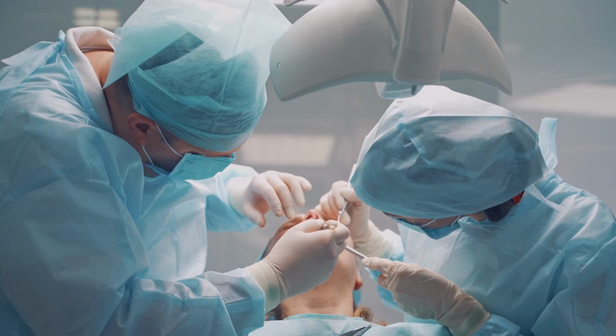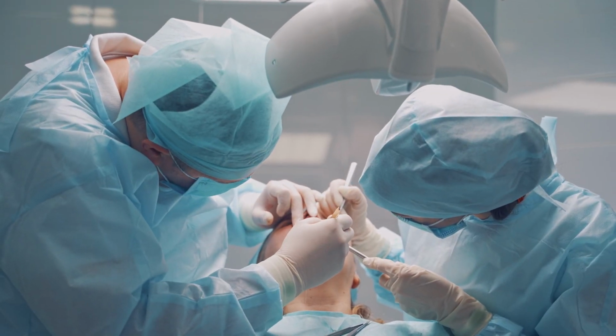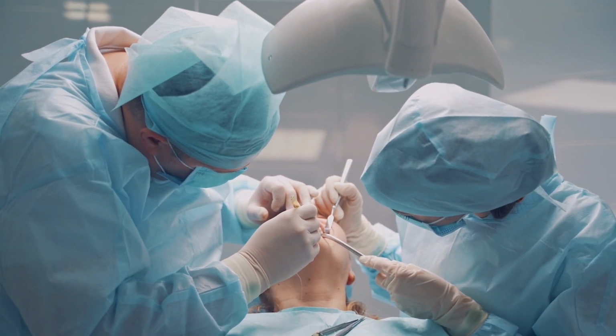So the day of the implant, people think it's going to be uncomfortable because you're drilling into my bone. But it's funny, I use less anesthesia when I do an implant than when I do a root canal, because all you're doing really is manipulating the tissue above the bone. Drilling into the bone, the patient really doesn't feel that. They may feel the vibration, but there's no pain associated with that.